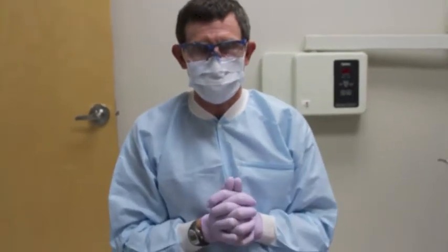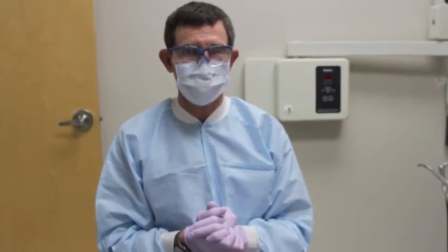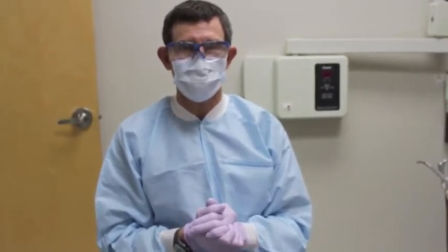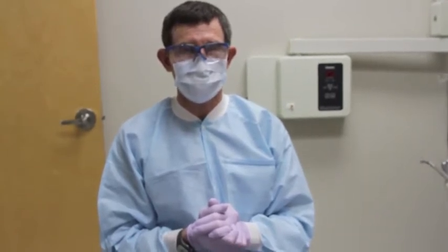As the doctor and the dental assistant are working together to provide restorative care, otherwise doing fillings, one of the things that is important is for both the doctor and the assistant to understand their individual roles and how their roles will complement one another. The assistant's major role is to provide the instruments and to provide the support so the doctor can remain working to provide the care to finish the case as quickly as possible. Speed is not the point, but efficiency is. So everything that we do, both doctor and assistant, is designed to enhance efficiency between the doctor and the assistant to provide care in the most timely manner.